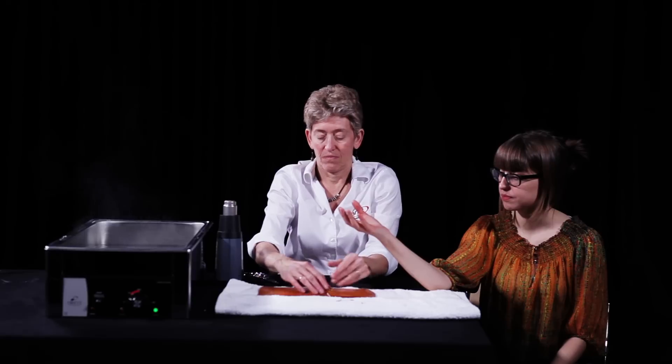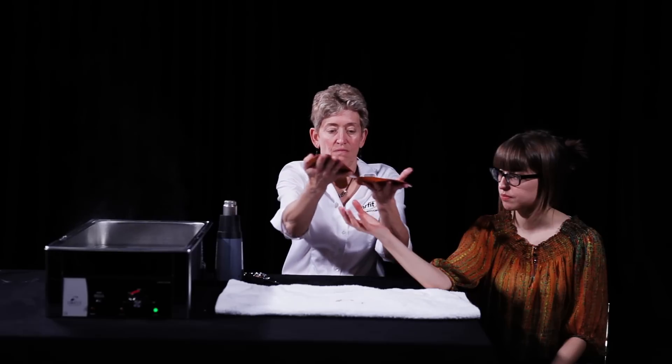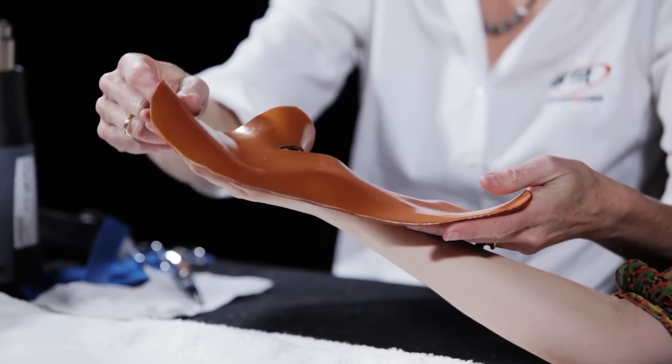The patient's hand is positioned with the forearm supinated and the elbow supported on the table. The thumb and fingers remain in as relaxed a position as possible.